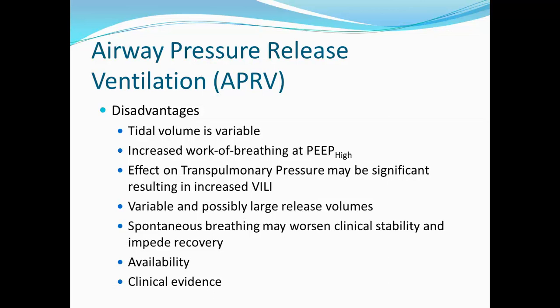Some patients in APRV appear to have a very strong inspiratory effort, and there is significant concern by some people that the transpulmonary pressure may be very high. Another concern that is expressed is the tidal volumes.